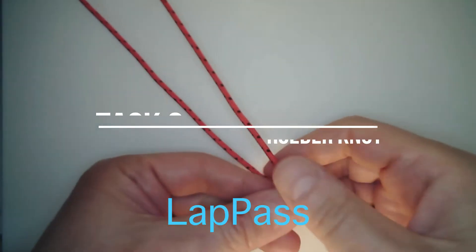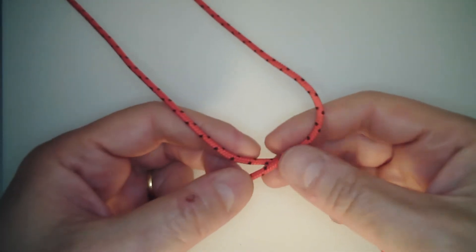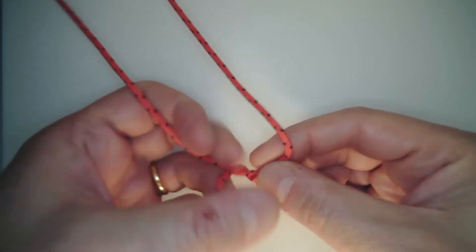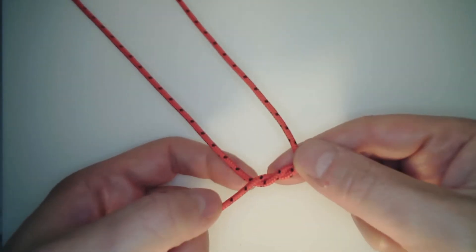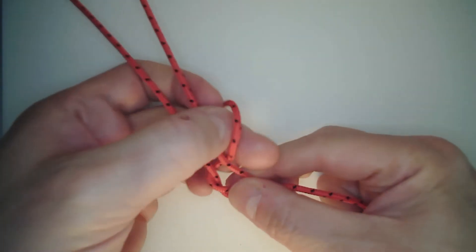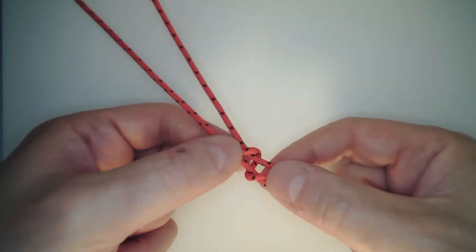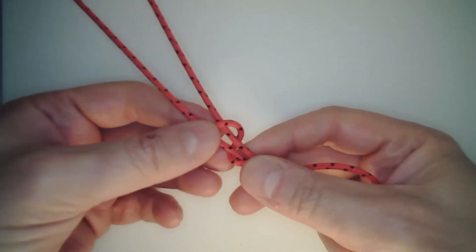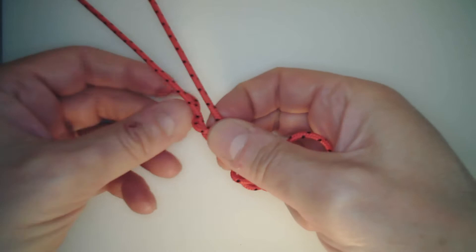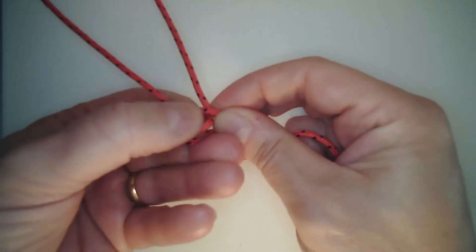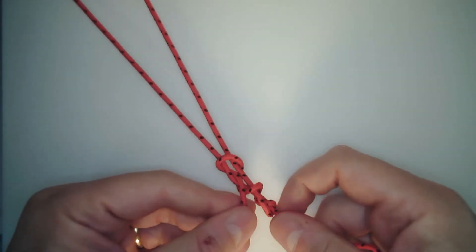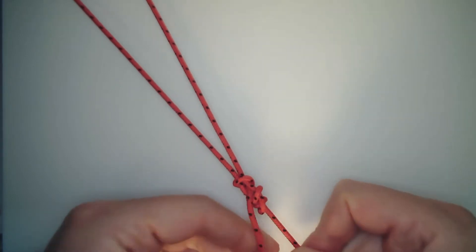Welcome to task two which involves forming an extracorporeal Roeder knot. I will demonstrate the knot which is a half knot initially, two full turns around the standing end, and then a half hitch locking knot.